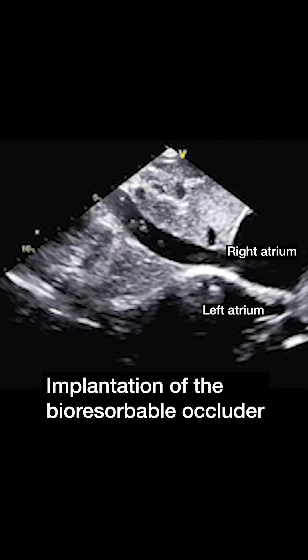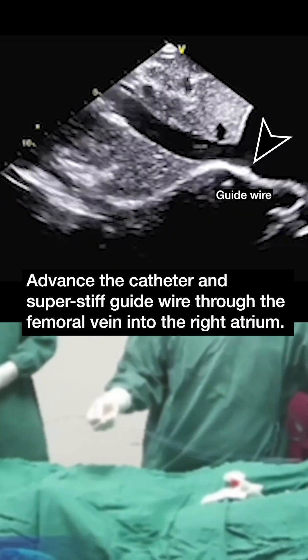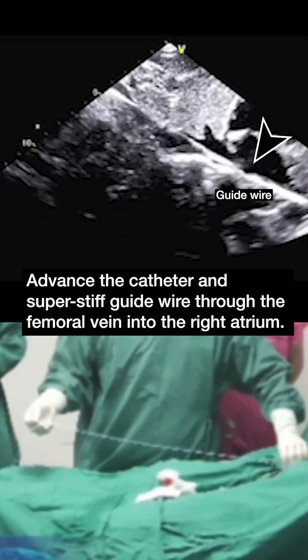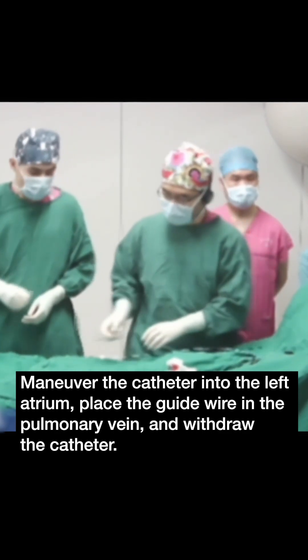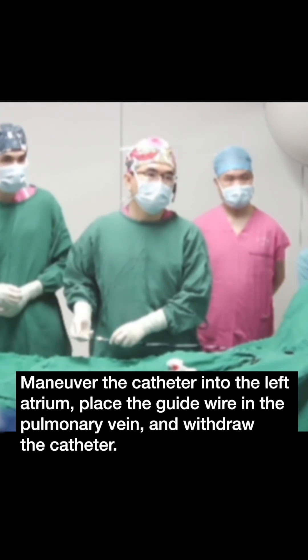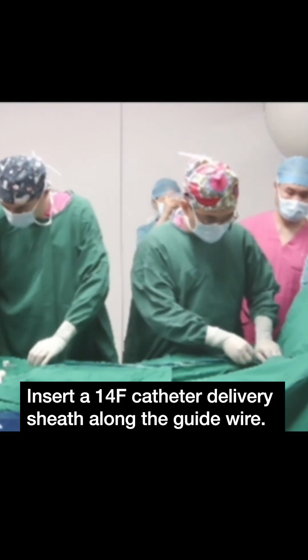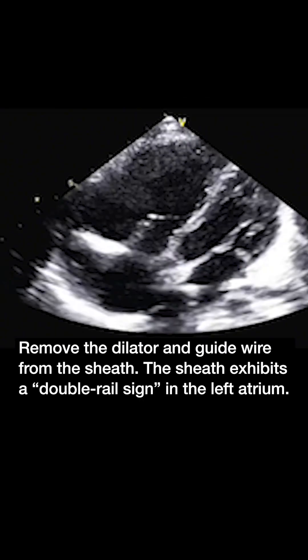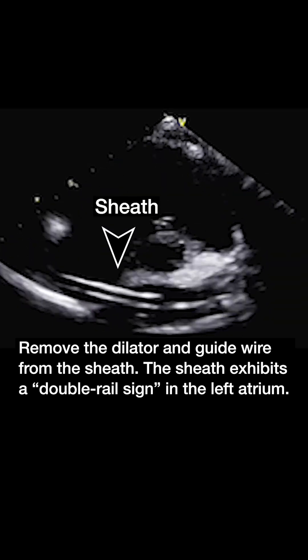Implantation of the bioresorbable occluder. Advance the catheter and super stiff guide wire through the femoral vein into the right atrium. Maneuver the catheter into the left atrium, place the guide wire in the pulmonary vein, and withdraw the catheter. Insert a 14 French catheter delivery sheath along the guide wire. Remove the dilator and guide wire from the sheath. The sheath exhibits a double rail sign in the left atrium.